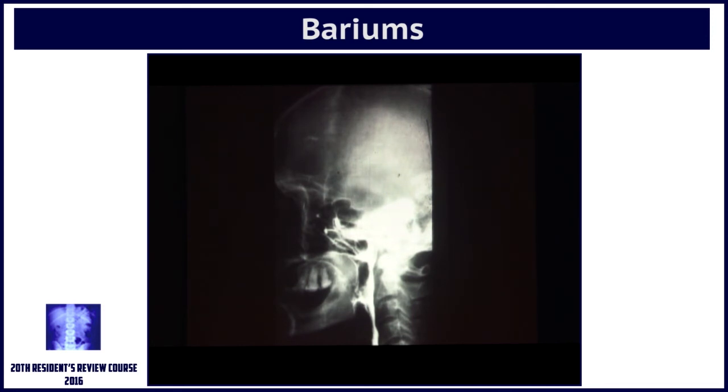The trick now is to do it properly. What do I mean by properly? You instruct the patients properly. You know, so many times I see in CT scan, "lamba shwas lo, shwas band karo, shwas lo, shwas band karo." Try doing it yourself. It's very difficult. We don't even explain properly to the patient.